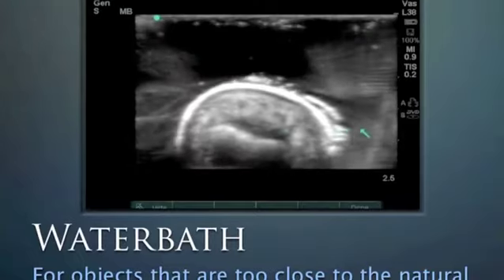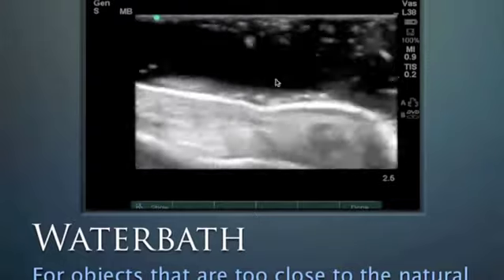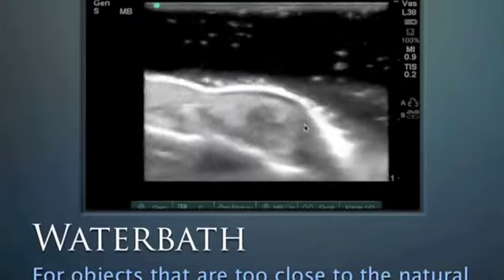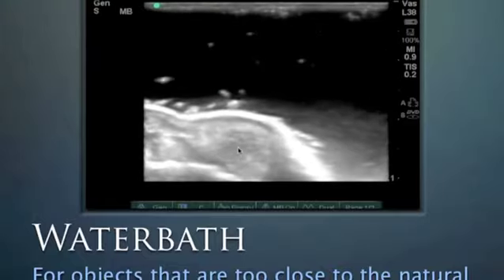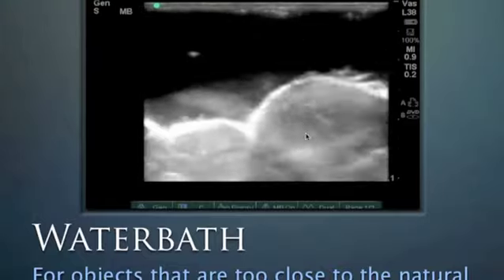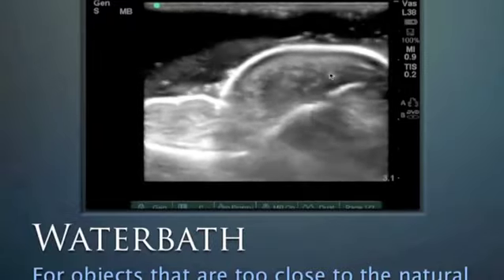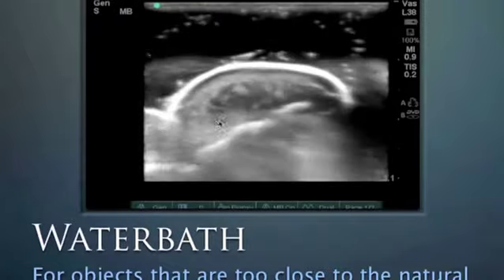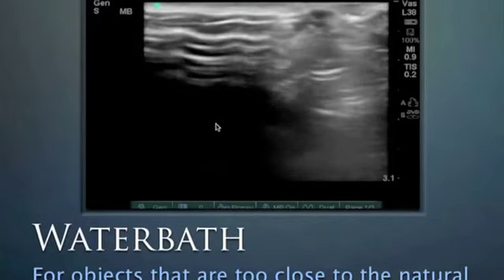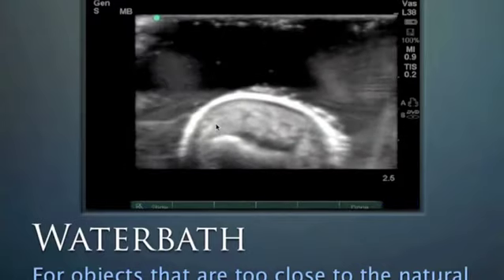This is another example of a finger, and now with the water bath, we stand away from this finger a little bit, and we can see this patient has an abscess here in the distal tip of their finger, and see it quite well with the ultrasound. The patient's moving their finger, and we can see it. This happens to be the thumb, and we can see this area of hypoechoic debris within the pulpy area of the thumb. Much easier to see when using the water bath.